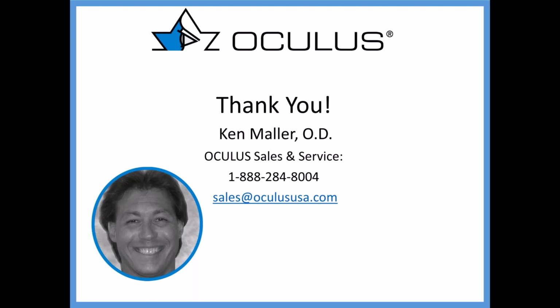This is an eye that this particular patient had written off 20 years ago and hadn't even ever dreamed of getting vision back. And not only did I have a lens that was comfortable, but I actually gave her vision as well. That gives them a lot more motivation. So I felt I was close enough that I went ahead and designed up a diagnostic lens with that first lens, and that's what I used as my diagnostic lens.